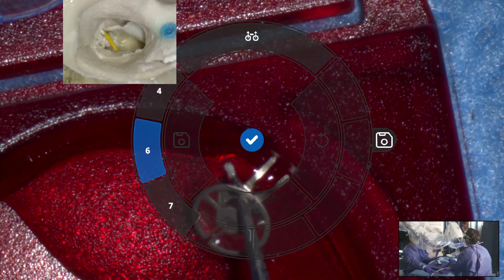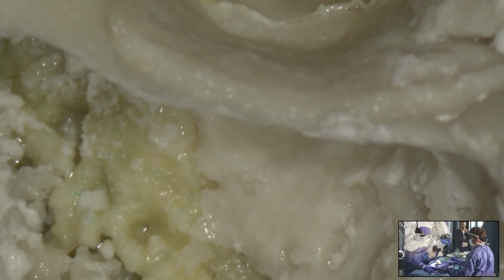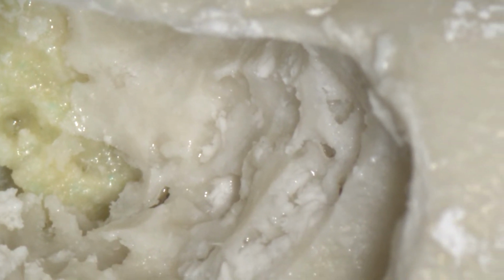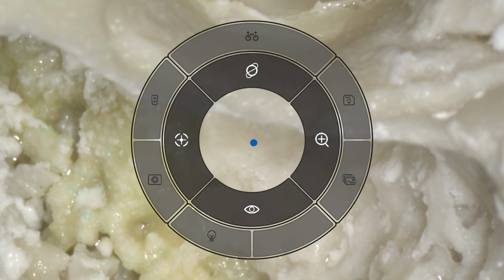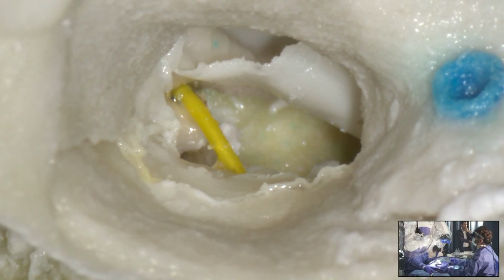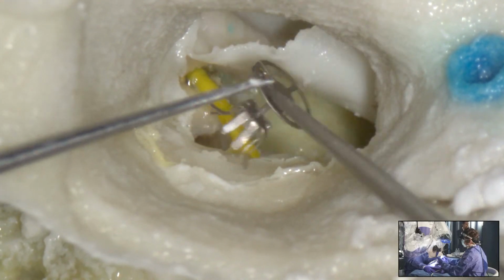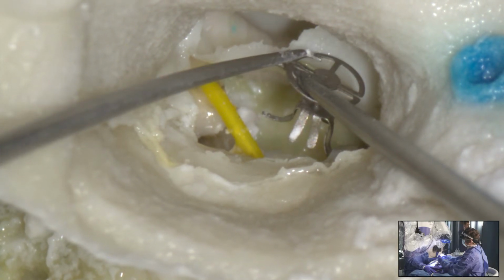Number 2. You can see here the image was captured while the position got saved, so that the prosthesis can safely stay in the hand of the surgeon. And for maneuvering, it's not essential to take away the prosthesis, since when you have the prosthesis once in your hand, you don't want to lose it. And even though the position is not 100% right, because the patient moved or you changed the table, you can just go from there and reorientate yourself and correct the position. And then you're safe with this highly sophisticated prosthesis in your hand.